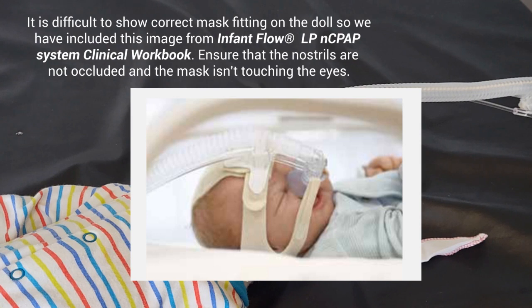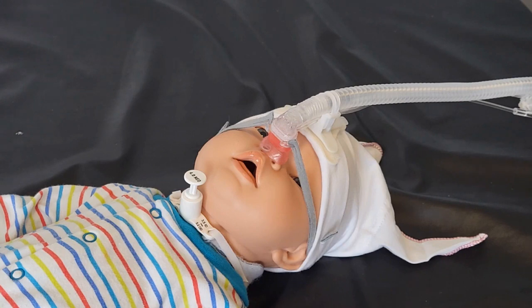We should be doing our pressure area checks along with our alternating of mask and nasal prong, so four to six hourly. We should also be re-measuring head circumference weekly for our bonnets to see if the patient's head has grown and needs a different size, or if the bonnet has become too slack and needs a replacement. You're now ready to start your CPAP. If the CPAP is alarming and you've set the parameters correctly, it may be that you don't have a good seal, so you'll need to adjust the mask until you've achieved a good seal and a good level of tightness.